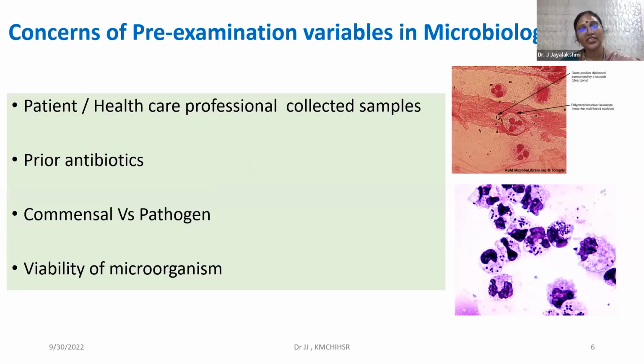So they are very particular in their requirements for specific organisms. We need to look at how we can keep this microorganism viable, which would be another area of concern for us. So these are definitely concerns for microbiologists. Like I mentioned to you, except the sample, everything else has to be sterile. It has to be aseptically collected, and brought to the laboratory as early as possible.